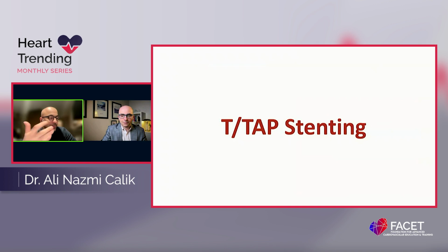But to be honest, if my procedure is elective, I always use 7 French, which really makes my life easier, because the quality of your equipment may not always be optimum, you know. So 7 French really makes my life more comfortable in these lesions.